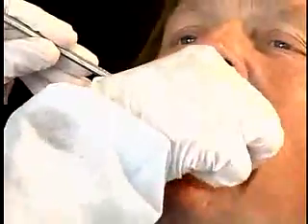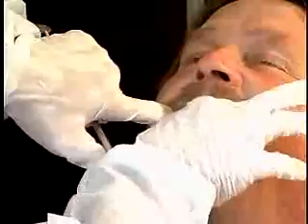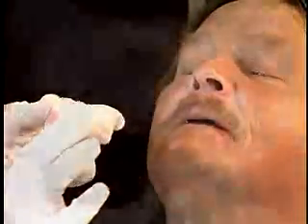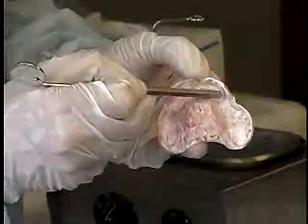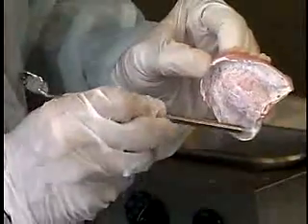Remove the dentures from the patient's mouth. Observe the areas on the tissue surface of the denture where the paste has been displaced by heavy contact with the tissue.